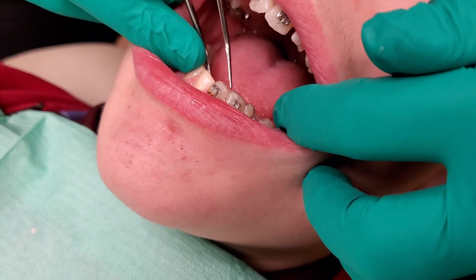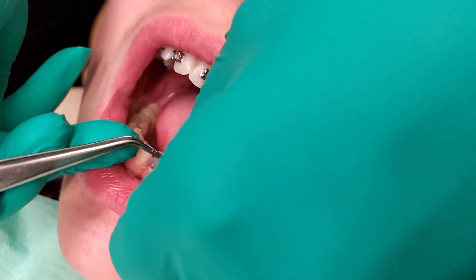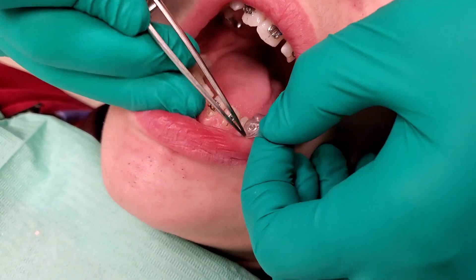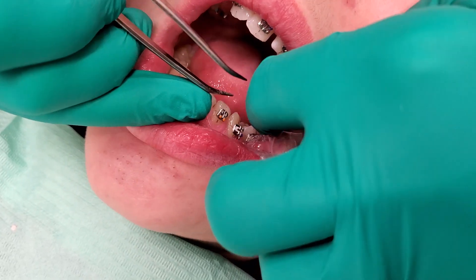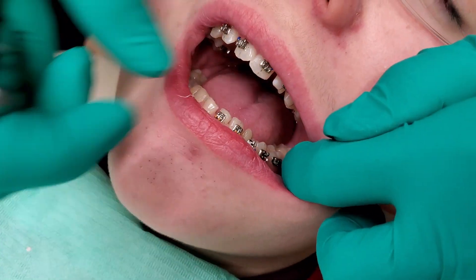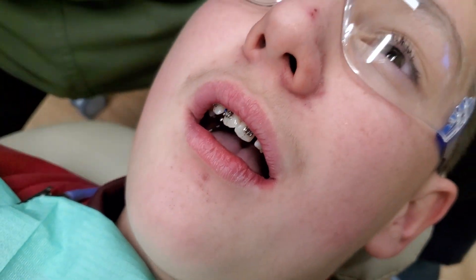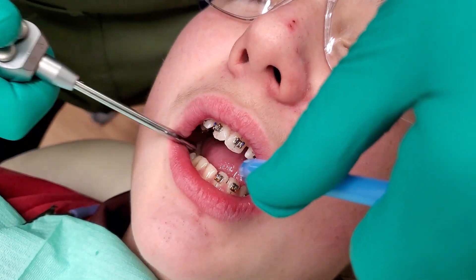You just grab an edge from the lingual with the cotton pliers — that's how I do it. I usually just start up here where it's easier and do this as carefully as I can. If it feels like it's hung up on the bracket, I'll use my tweezers to help tease it off — usually it's that longer prong on the bracket that'll do that. And then once you get to here, it usually just comes right off. I usually give them a gentle little push with my fingers just to make sure they all seem seated. Give them a little rinse after because I'm sure it tastes like those. You can close.